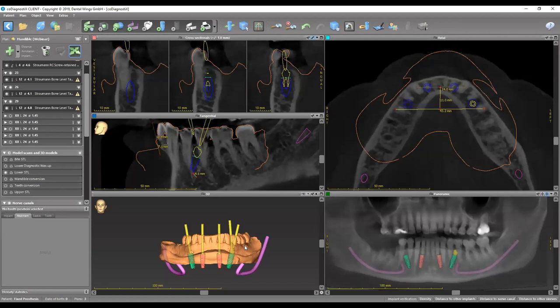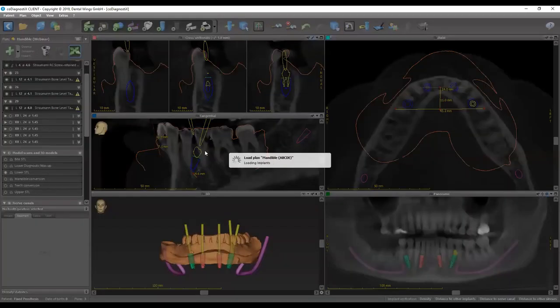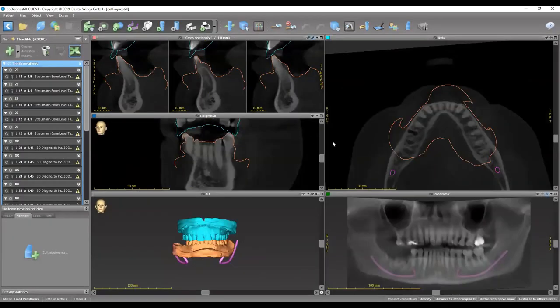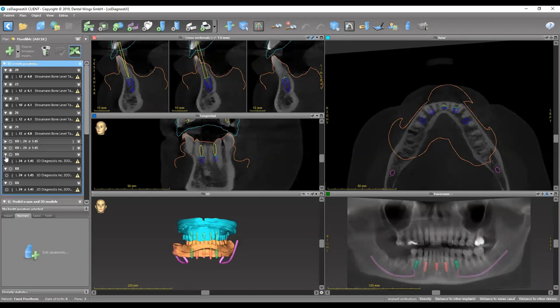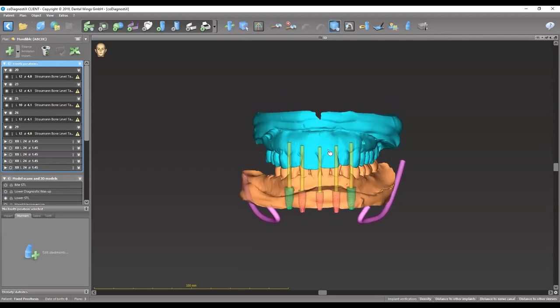We're going to check another plan according to the guidelines Dr. Carl Misch gave us. They recommend placing five implants at sites A, B, C, D, and E. So compared to the previous plan with distally inclined implants, here we have straight up and down implants at sites A, B, C, D, and E: C is the midline of the arch, B and D are the canine sites, and A and E are the first or second bicuspid sites — giving five straight implants between the mental foramina.